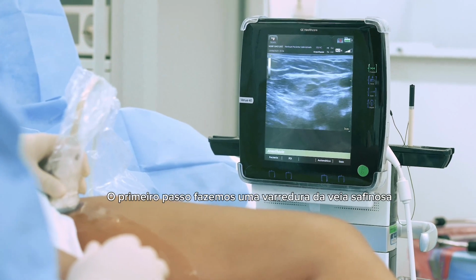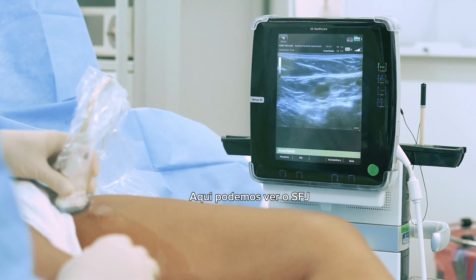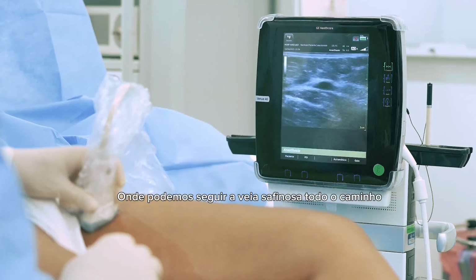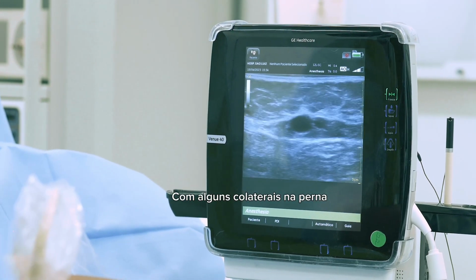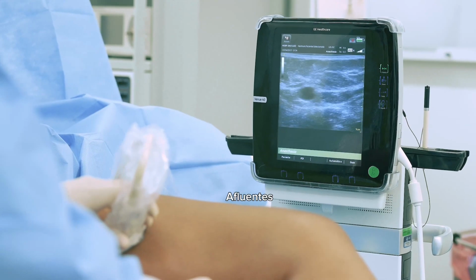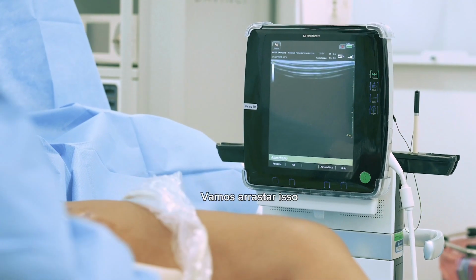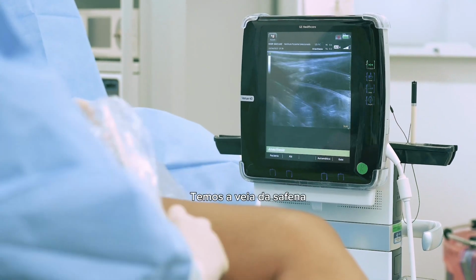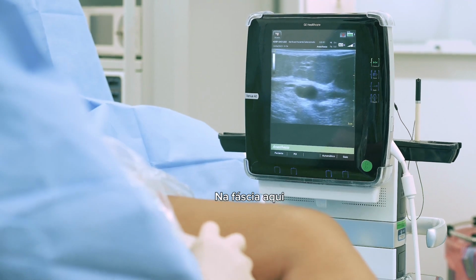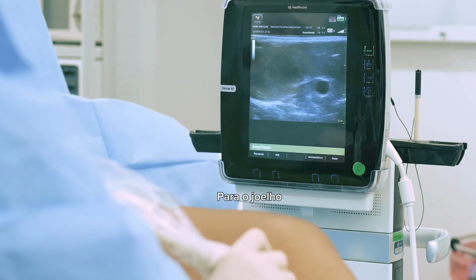The first step, we do a scan of the saphenous vein. Here we can see the SFJ, where we can follow the saphenous vein all the way down, with some collaterals in the leg, tributaries, and perforator veins. We're going to direct this through here and do the ablation. We have the saphenous vein in the fascia here. Then we go all the way down to the knee.